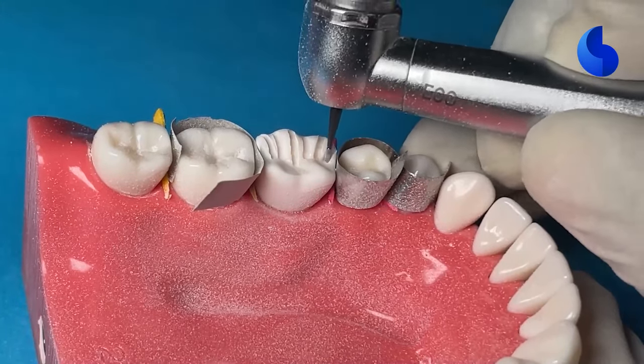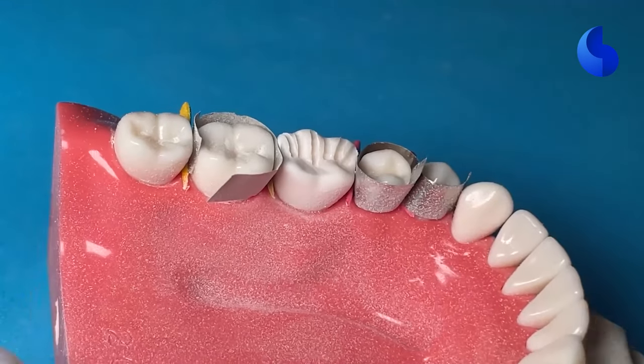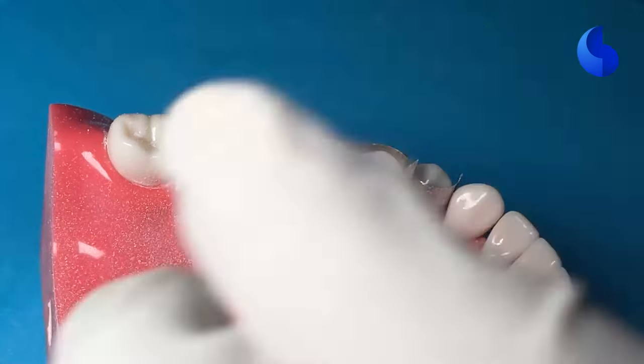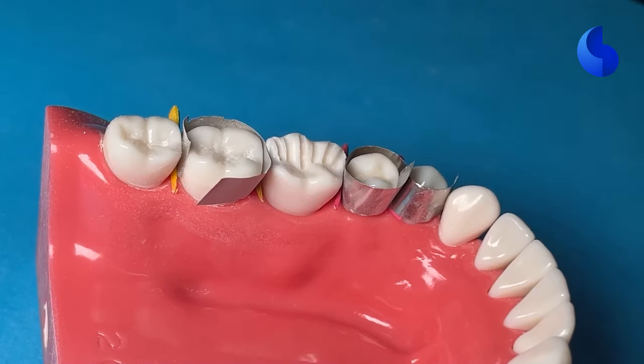You can also use a diamond burr, like an 856016. It's a round-ended tapered fissure burr that also works pretty well for this. You can also try your hand on a 55 or a 57 carbide. That can also be used.